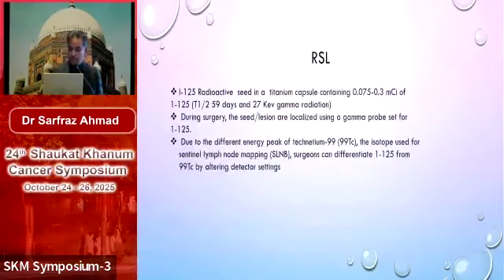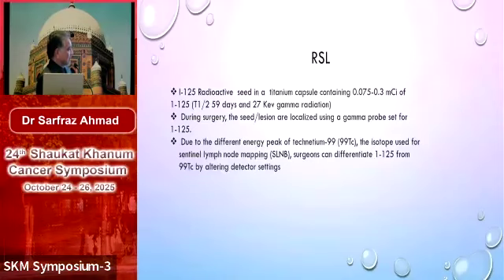So radioactive localizations, I will just quickly go through these. These are also not used in many trusts in UK, they are moving towards non-radioactive lesion localization. So this is radioactive seed localization.